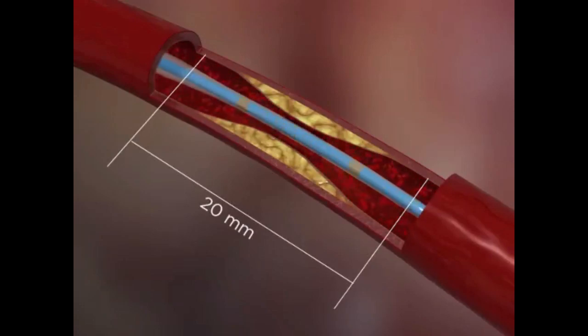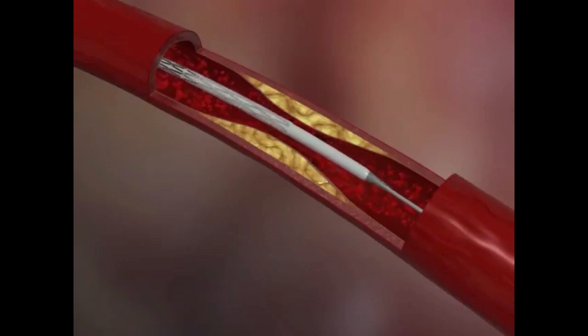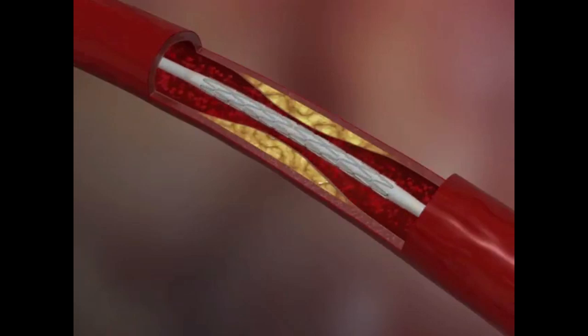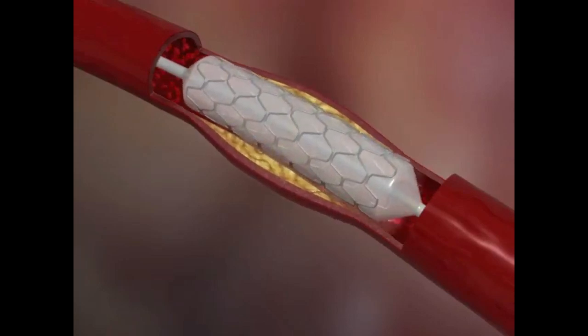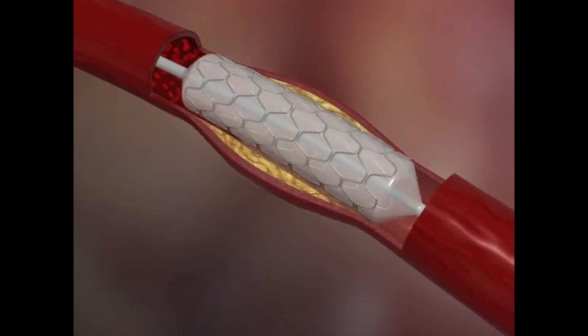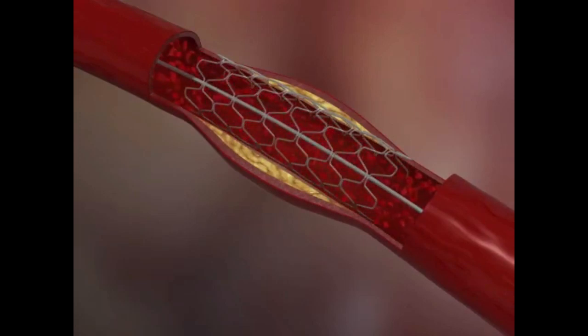the vessel. The preparation of the artery with the Amicath allows direct stenting to be performed without predilation with a balloon catheter and the risk of distal embolism. It also makes it possible to determine the need for thrombus aspiration prior to implanting the stent. The total duration of the procedure is very short. In the absence of a thrombectomy, it takes no longer than 5 minutes.